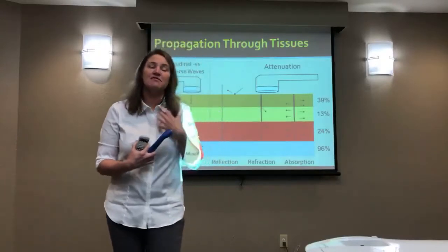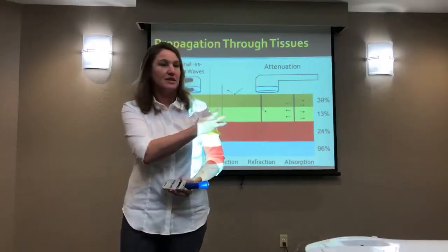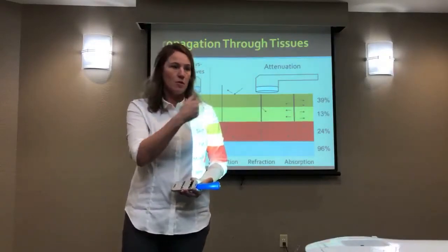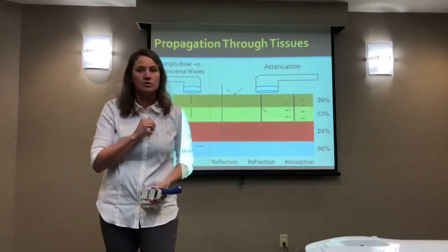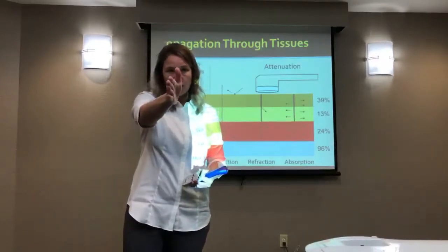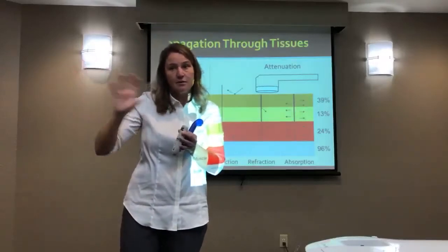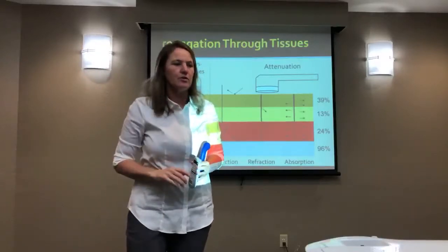But if I'm in the same vicinity, maybe if their pacemaker is in their chest here, and I want to treat this shoulder, then I really have to make sure that my target would allow me to aim the ultrasound in a way that it's not going to possibly encounter the pacemaker. So it's more a matter of knowing how the ultrasound travels, and the fact that it goes where you aim it. And if you aim it this way, it's not going to go this way. It's not going to take a 90-degree curve. However, if it's in the path, but a little over the side, depending on how deep you're going, it could possibly spread and get into that pathway. So that's another way of thinking of it.